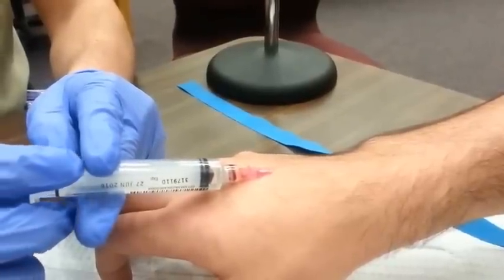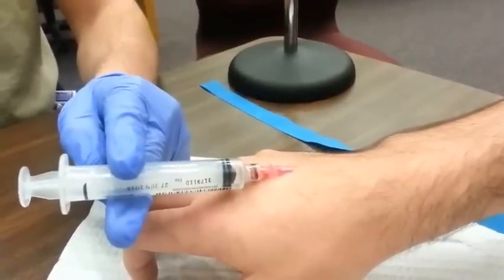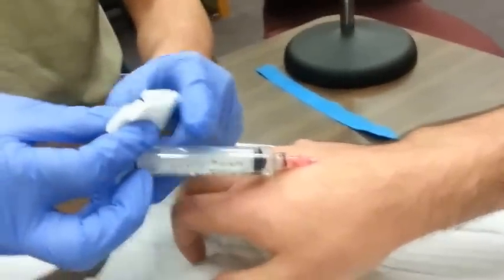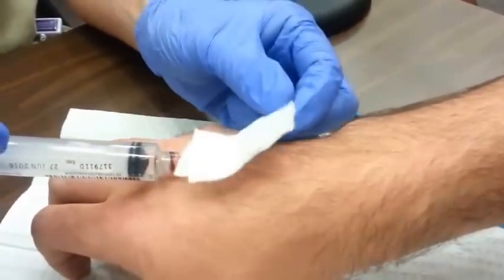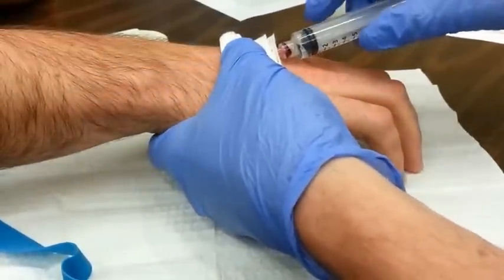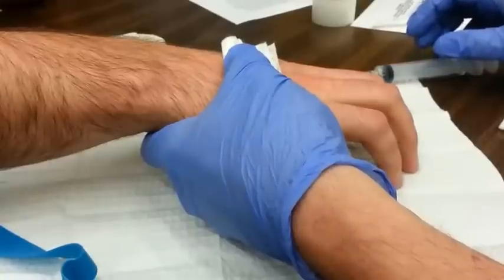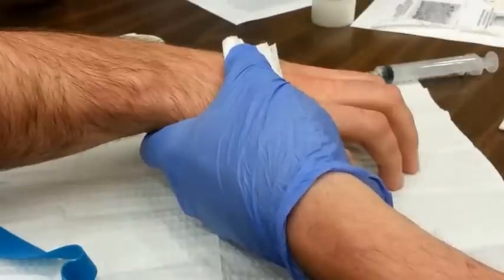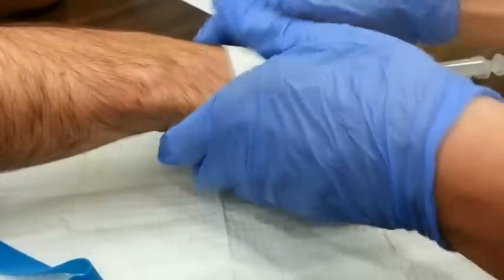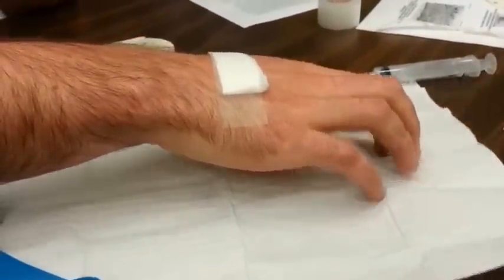In this case, we are simply going to remove our entire catheter and syringe in one fell swoop, and we will show you how to successfully remove a catheter. To do this, you will need a two-by-two-inch gauze pad and place it just proximal to where the catheter enters the skin. Applying pressure, remove the catheter and syringe in one swoop, applying pressure on the puncture site. You can now apply a bandage or tape the two-by-two in place. And that is how you start an IV catheter in the dorsum of the hand.